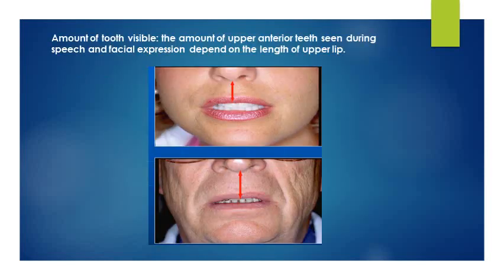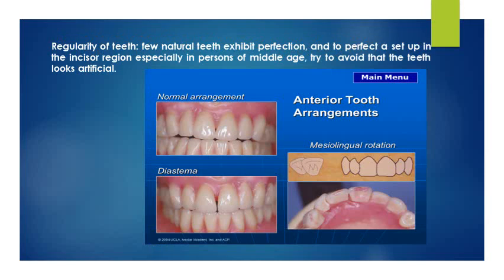The amount of the teeth exposed is different between people and between ages, between male and female, between young and adult, as you see in the picture.